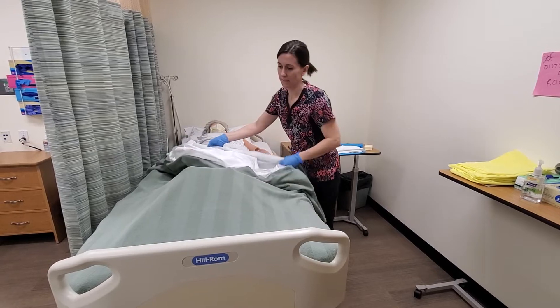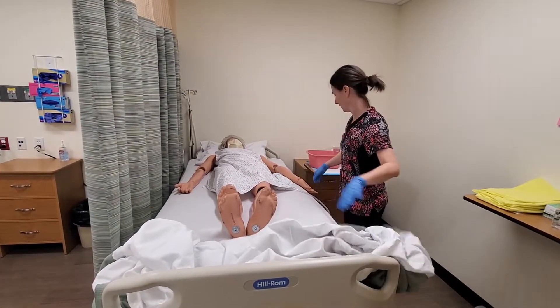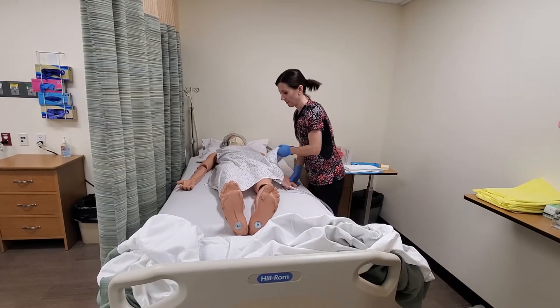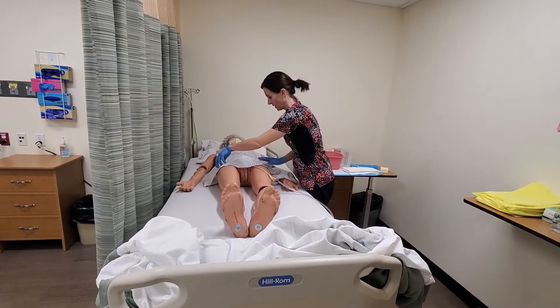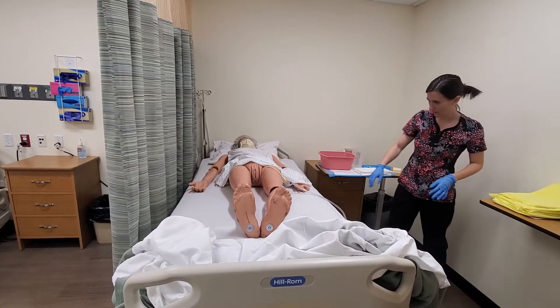I'll move the covers from the resident and lift the gown just to expose the perineal area only. I'll make sure that there are no kinks or restrictions in the tubing at all.